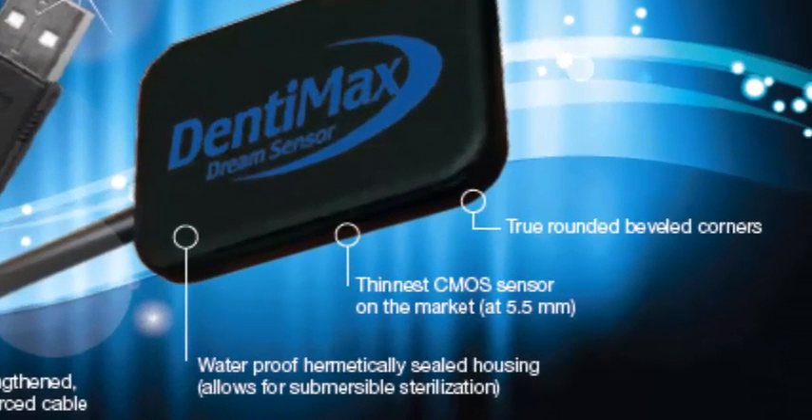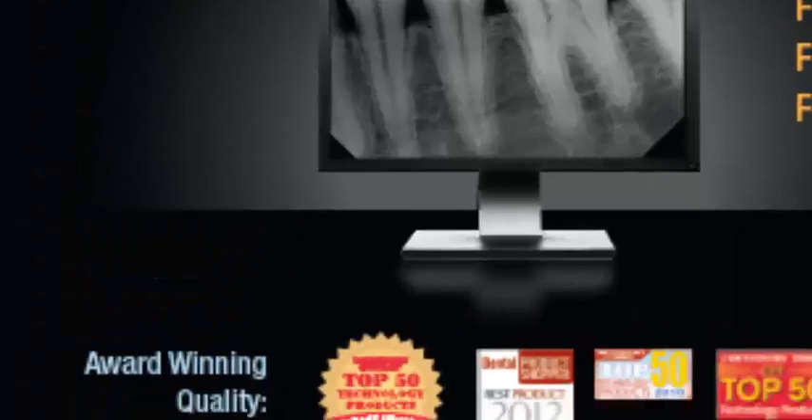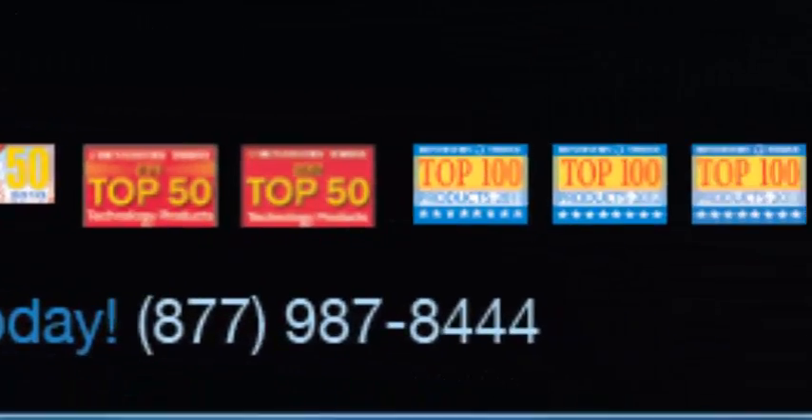It's a waterproof, hermetically-sealed housing on the sensor, so you can actually submerge the sensor to sterilize it. It is advertised as the thinnest CMOS sensor on the market at under 5.5 millimeters. To add more to patient comfort, we have extreme rounded corners on all four corners of the sensor. It's won all sorts of awards. You're going to love the sensor.